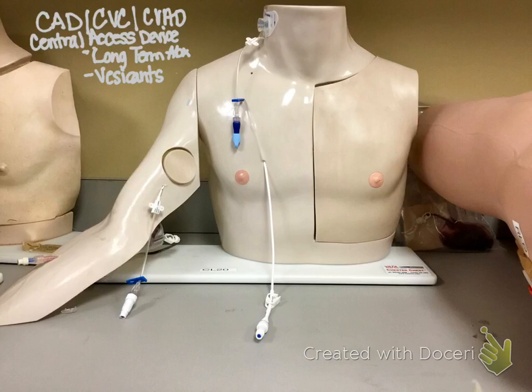A lot of times vesicants also leak out of the veins, and there's a fancy word for that, and I'm probably going to butcher how to say it, but extravasation, when they leak out and cause tissue damage. If you've worked in healthcare, you've probably seen something like that. It looks horrible. So you want to have a central line to prevent those vesicants from damaging the tissue.